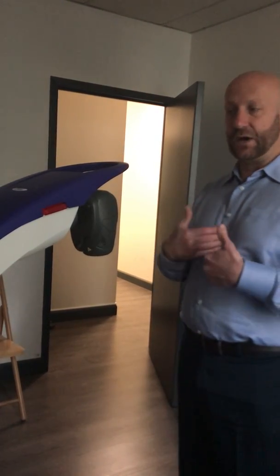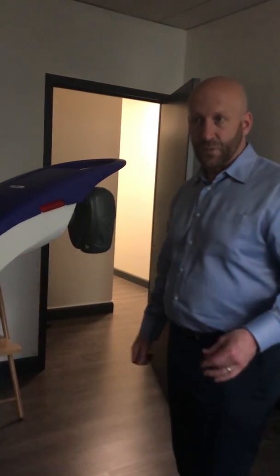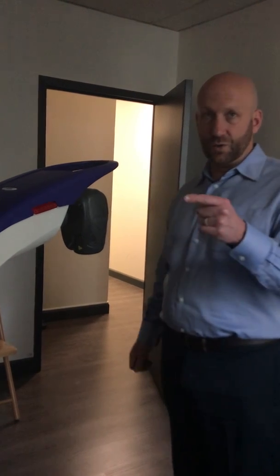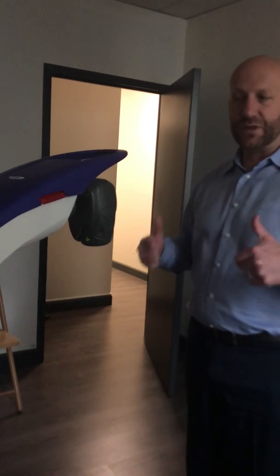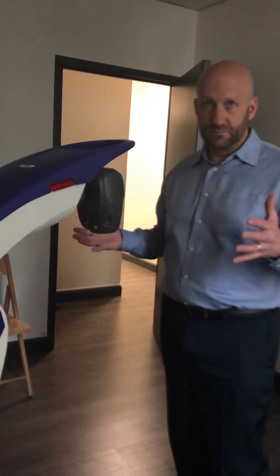Okay? If I tell you that there is no improvement, time is the variable for energy. So you're going to increase the time by 2 minutes. There's literally going to be a cheat sheet here, so you don't forget. So no improvement, you increase time. If this laser is causing pain, what do you do? You decrease time because you're decreasing the amount of energy. In theory, that should give the patient a good treatment with no stiffness or soreness. Okay. That's it. That's literally it.